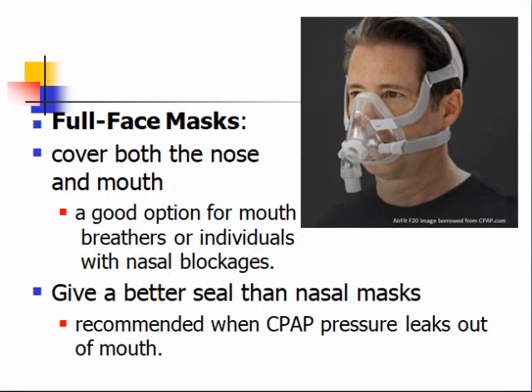The full face mask covers both the nose and mouth. This is often necessary for patients who are mouth breathers, who have blockages of the nasal airway. It is more confining and a little more difficult to fit. However, some say it gives a better seal than the nasal mask. And it's best when the CPAP pressure leaks out of the patient's mouth if they're using a nasal mask.